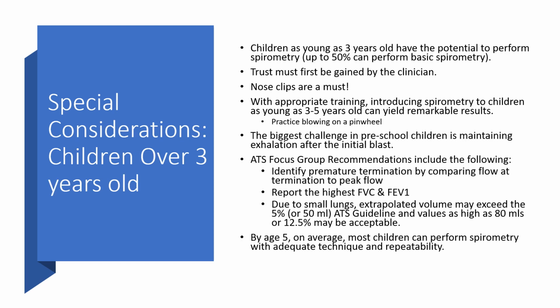Some additional special considerations for children that are over 3 years old. Children as young as 3 years old have the potential to perform spirometry. Up to 50% can actually perform it. Trust must first be gained. So think about it: you work in a pediatric unit, irrespective of what you're doing, you need to gain the trust of the child. Nose clips are pretty much a must.